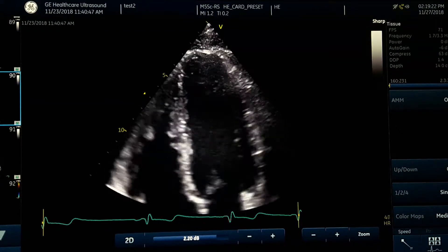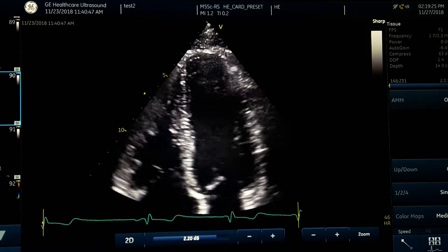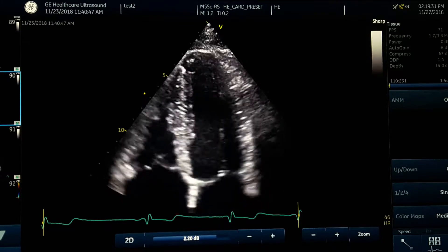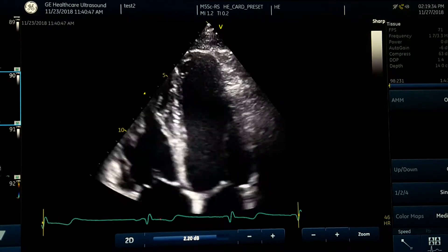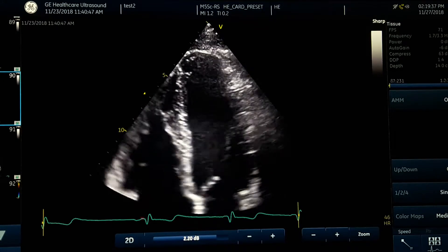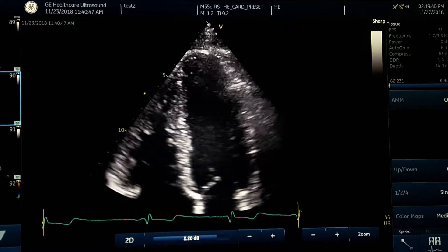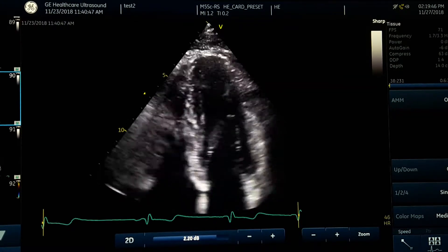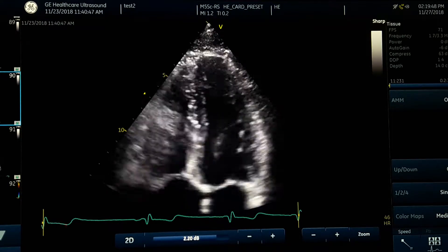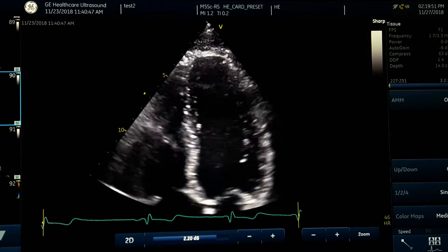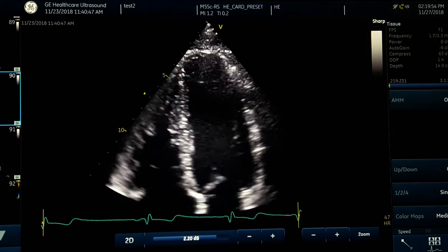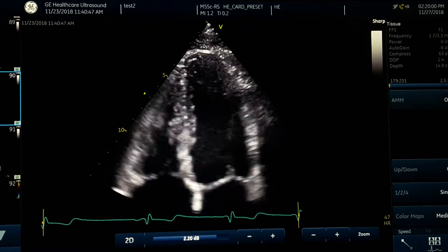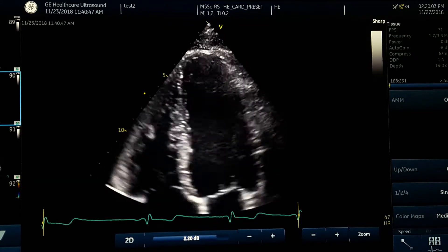One of the important duties as an echotech is evaluating and ruling out apical thrombosis, especially in patients with ischemic heart disease who are hospitalized and in whom the doctor is suspicious about a heart attack, or who have actually had one. In those cases, the treatment plan will differ, so it is very important for the doctor to be sure whether any thrombosis is present or not.